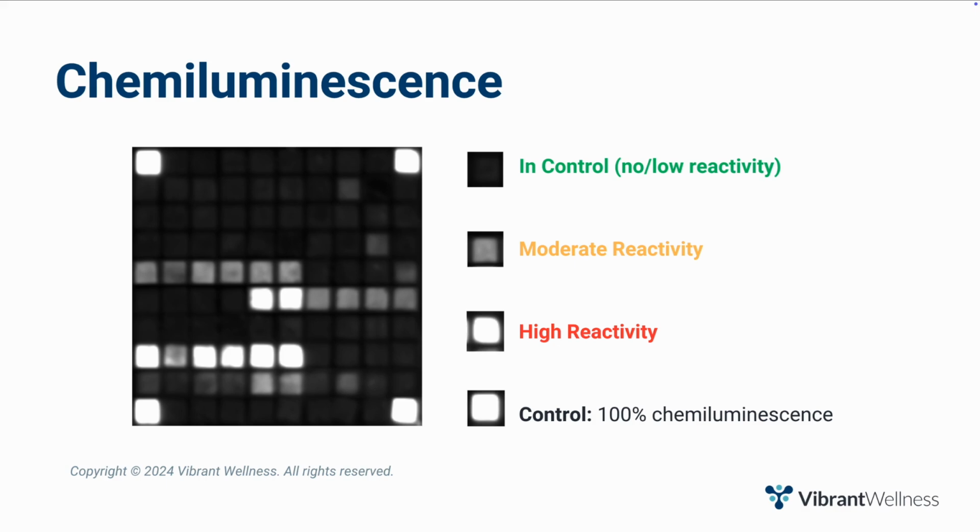Finally, a high-resolution imager is used to simultaneously detect chemiluminescent signals from labeled antigen-antibody reactions at each microchip throughout the multiplex microarray. Amplified chemiluminescent signals with high signal-to-noise ratio provide high sensitivity, meaning very few false negatives. This automated process allows for high-throughput, sensitive, and specific analysis of multiple biomarkers from minimal sample volumes.